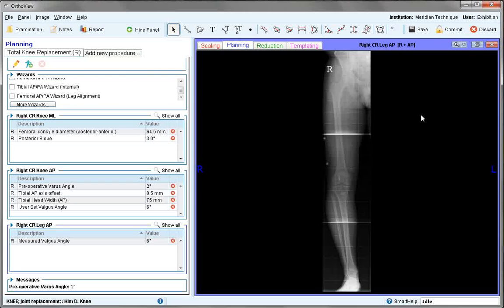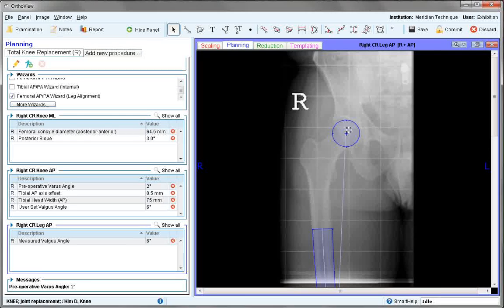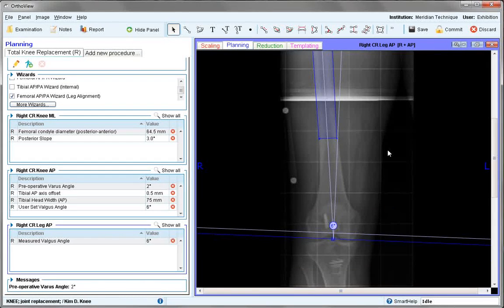For this particular image we will look at the femoral leg alignment wizard, which only applies where you can see hip and knee on the one image. This just measures the varus/valgus angle of the patient. The femoral head is outlined, along with the femoral diaphysis and the base of the condyles, giving a value of the current valgus angle.